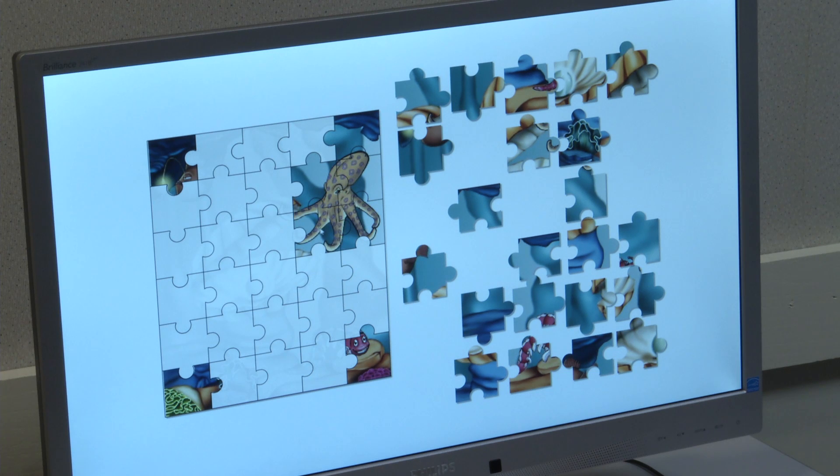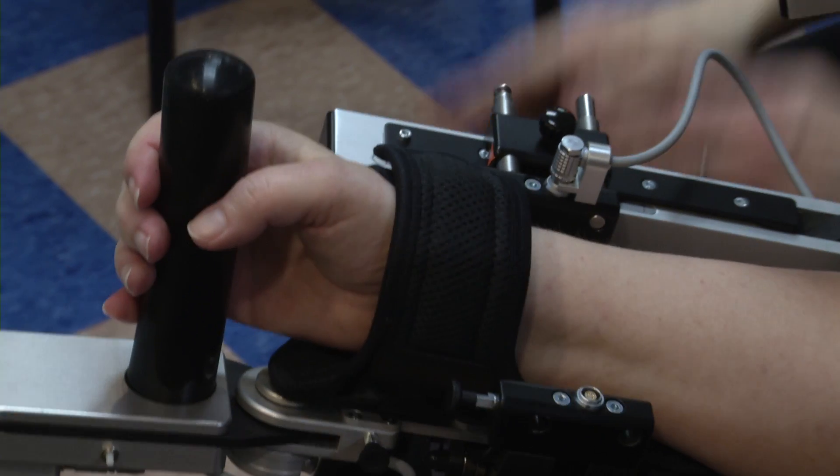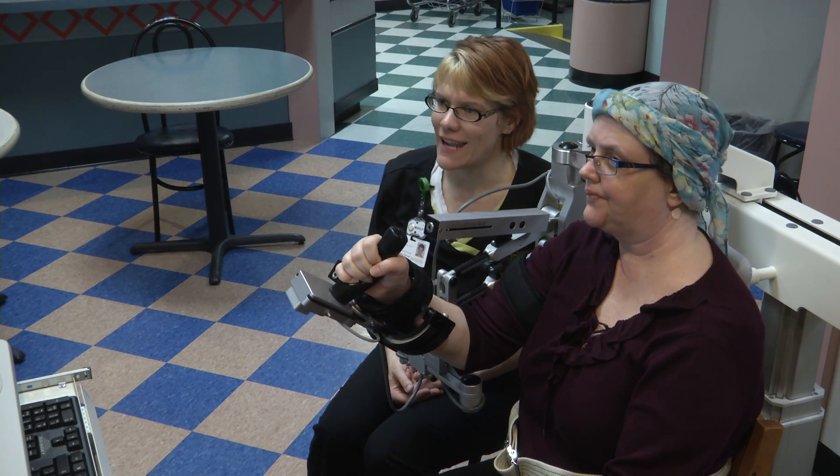Elbow flexion and wrist movements. It's a good way to help people have a visual component to their hand-eye coordination that doesn't have any risk involved during a functional task.